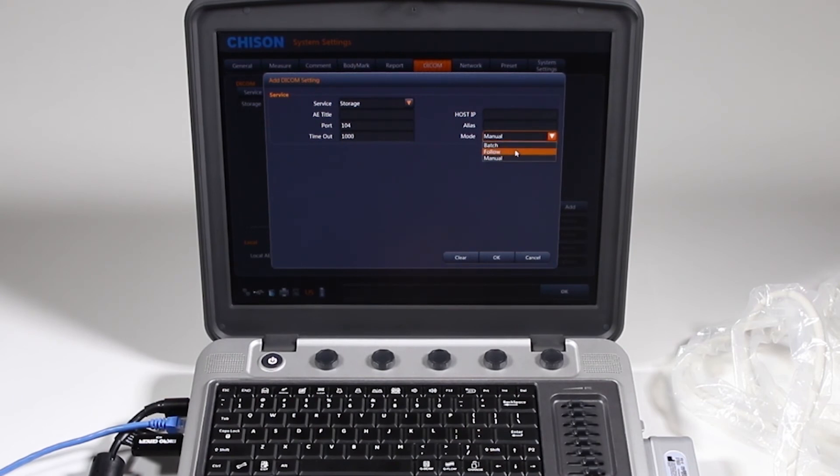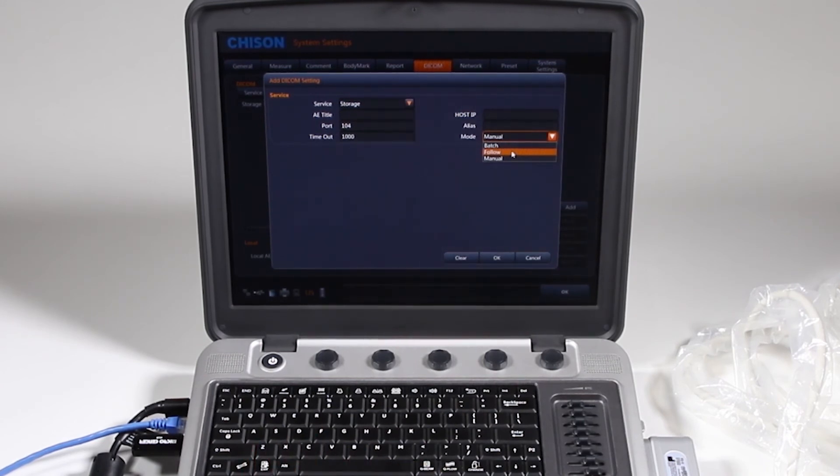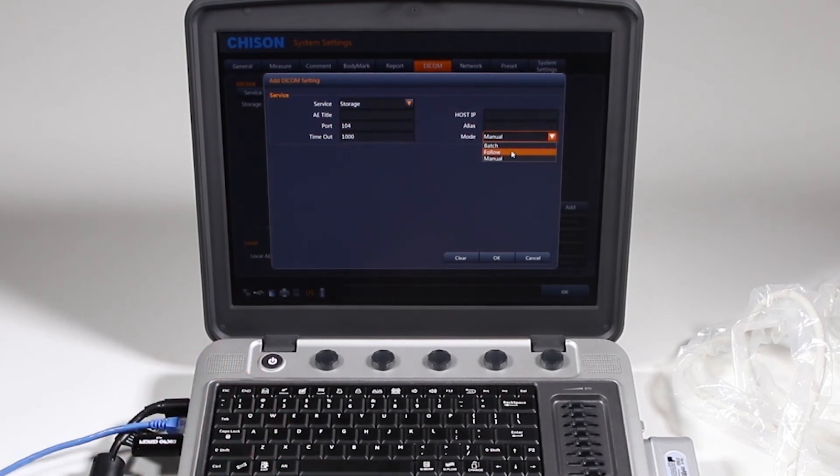So if you say each time they send exam, you can follow, meaning as soon as you press end exam, it will go directly to that DICOM server. Of course, you'll have to make sure you're connected each time.